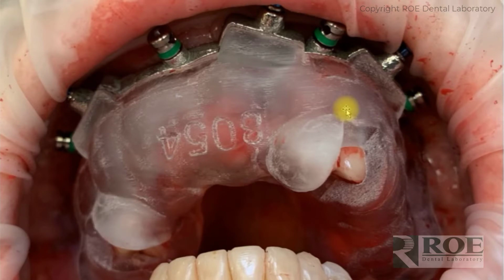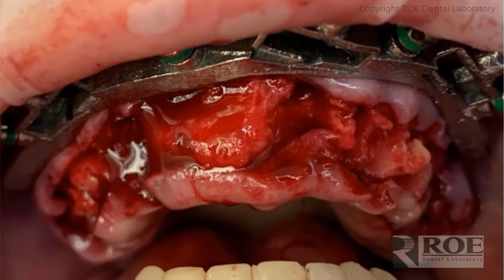Now there's step-down because the apical 4 millimeters of the drill is a step down to 1.8 millimeters, where the rest of the drill is 2.0. And the pins were made in conjunction with them. So you'll tap the pins in with a surgical mallet, and you'll find that it's very secure on every case. They are transcortical, so you are tapping into the lingual cortex, and it will be tight.